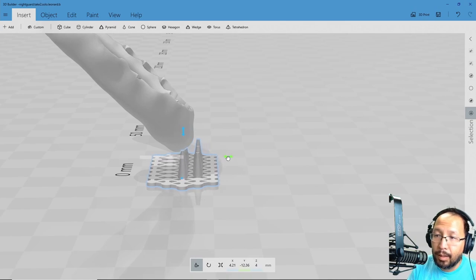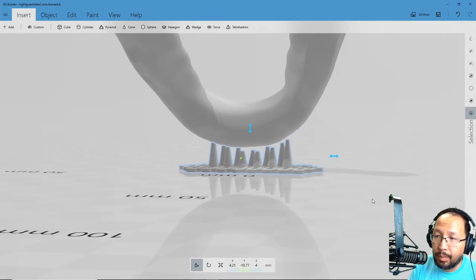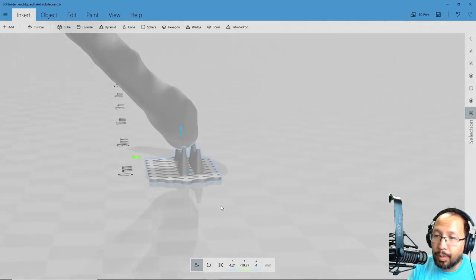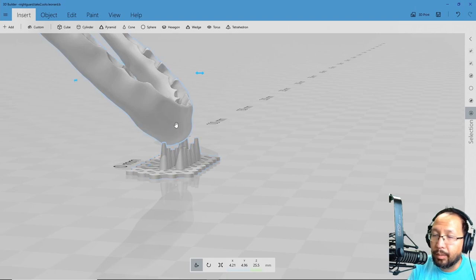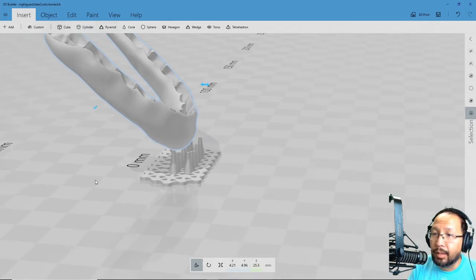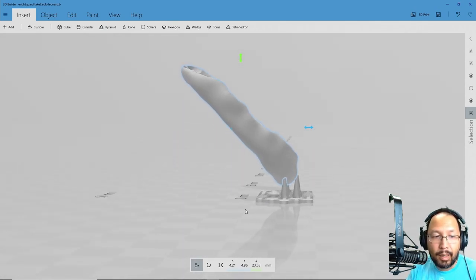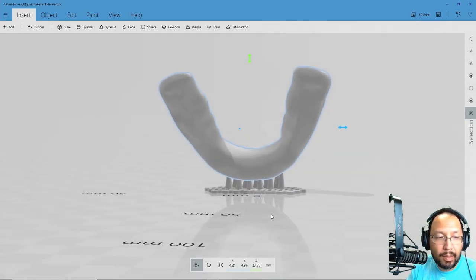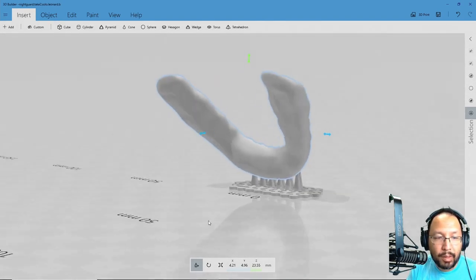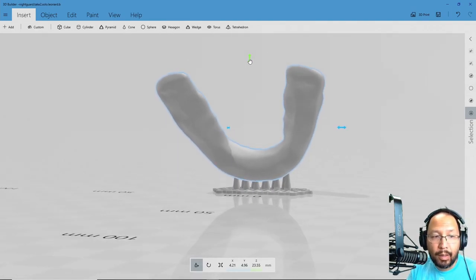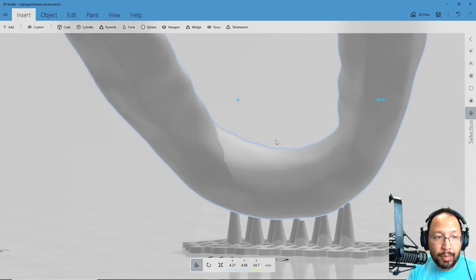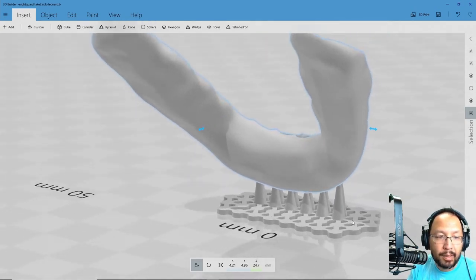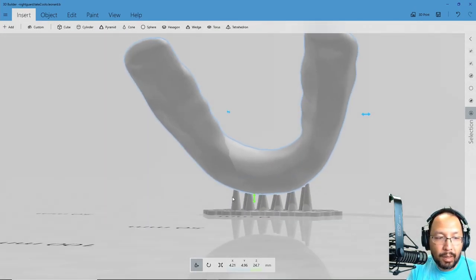And now we're going to go back to this view or this direction here. And we're going to translate our thing here. And then we're going to look and what I'm looking for is to see if my spikes are correctly superimposed. And you can see there's a lot of spikes that aren't touching. So maybe my translation was a little bit too high. I'm going to click this model. Now I'm going to unclick that one using my right button and I'm going to lower it down until it is correctly centered. So here we go. We're going to lower that, drop that down. You can see it kind of snapped for me. So there was probably some sort of centering that went on there and this isn't perfect, but it will print. You can raise or lower this depending on how much engagement you get. I will tell you that the fatter the contact area between these spikes and the print, the more reliable your print will be. You'll notice that I have shorter spikes in the middle and longer spikes at the periphery. And that's intentional because your night guard will tend to be lower in the middle.